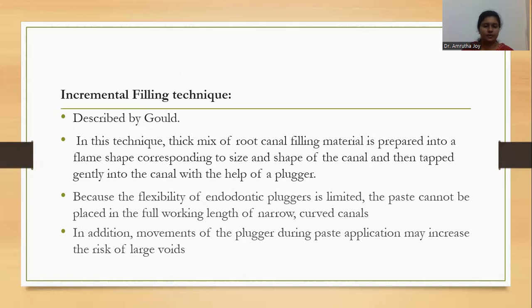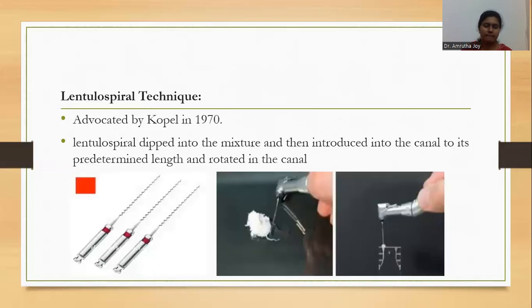But in case of curved canals or narrow canals, the paste cannot be placed to full working length because of the lack of flexibility of endodontic pluggers. And the repeated movement of the plugger during paste application may increase the risk of making voids in the root canal filling material.